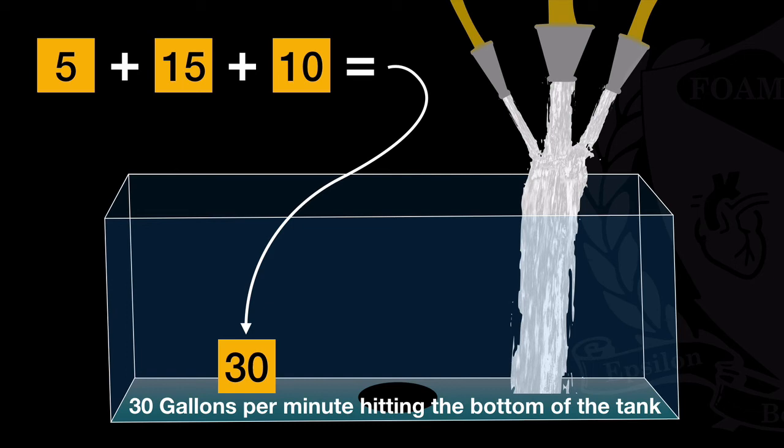But it is true that when we give these patients high flow devices, so we run a lot of volume through their nose, and then we ensure that when they breathe in, they're at least getting some volume through the mouth as well with a non-rebreather, that we are decreasing the amount of dead space. So we are building up a little bit of reserve, and that does make up for some of their dead space, and that does factor into the equation if we were looking at actual volume being delivered to the lungs, but we're just talking about speed here.